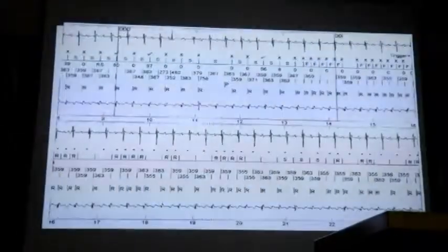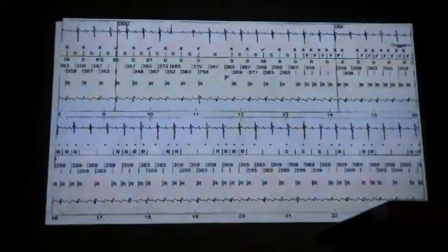And all the time we would measure the R wave, measure R wave, measure R wave. As his heart rate came up, his R wave was doing this. At about 160, it hit the point at which it started to pick up his T waves.